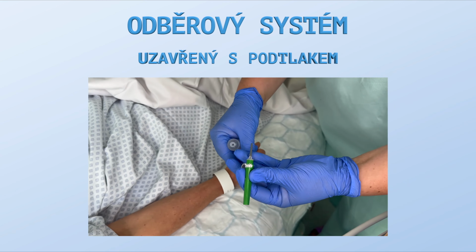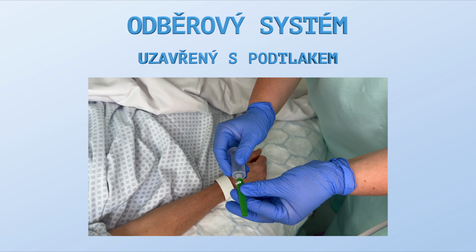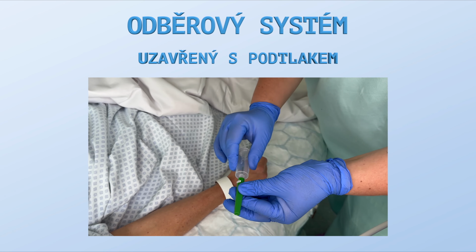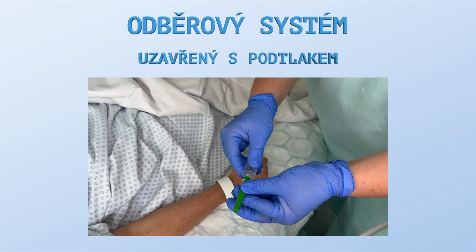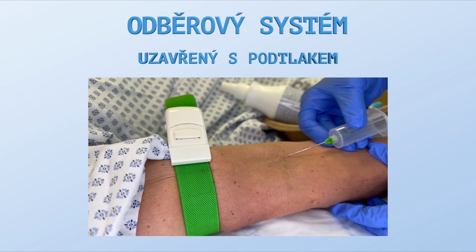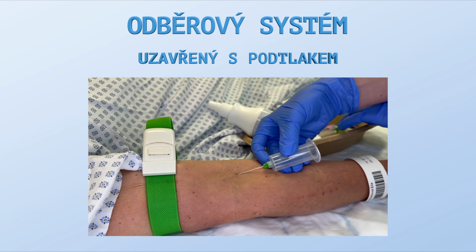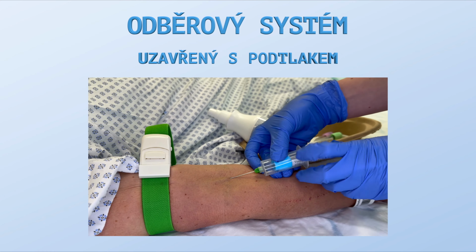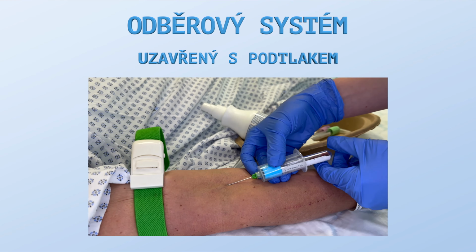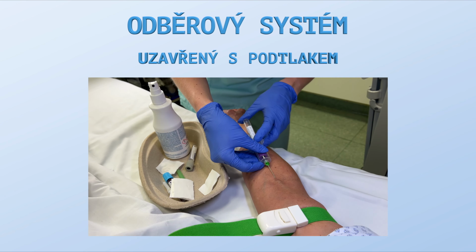Closed blood collection system with negative pressure, vacutainer system. The vacuum blood collection set with negative pressure consists of a collection needle, a cap-like introducer, vacuum tubes, and other possible accessories. The double-sided metal puncture needle is stored in a double-sided screw-on sterile cover and is designed to be attached to the cap-like introducer. This type of collection set eliminates the possibility of contact between the healthcare worker and the blood, reducing the risk of injury.